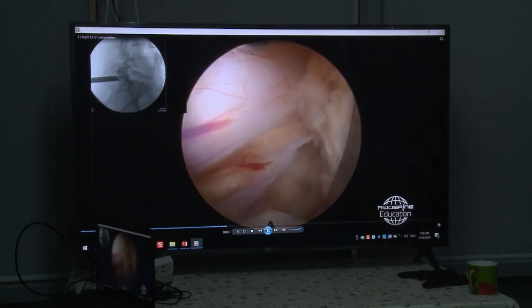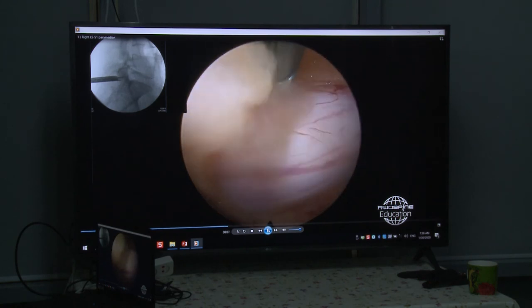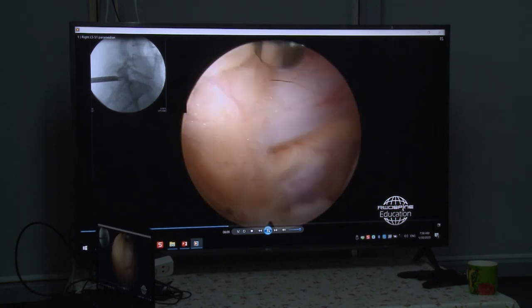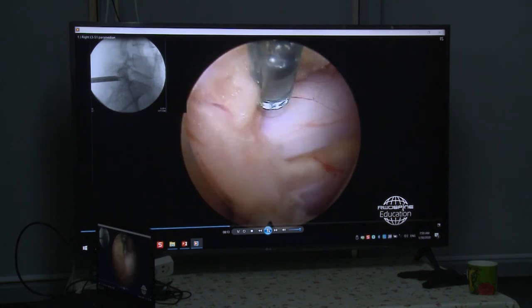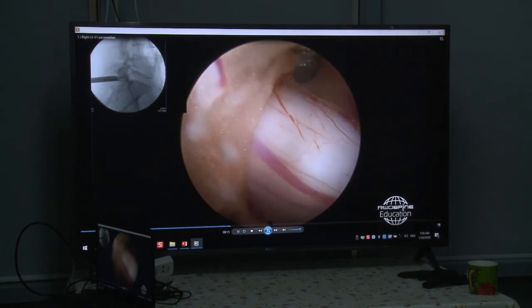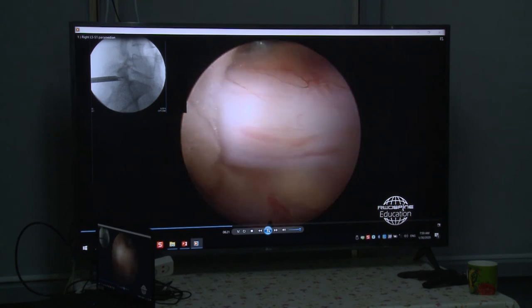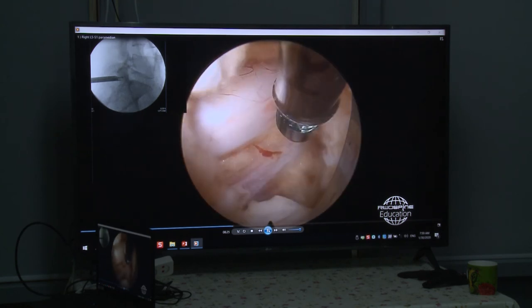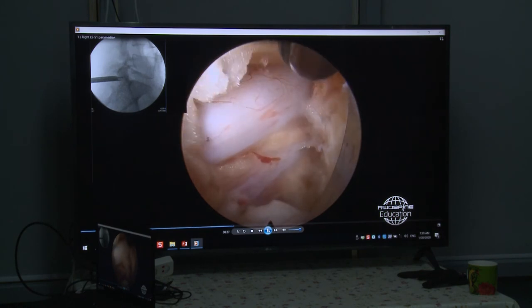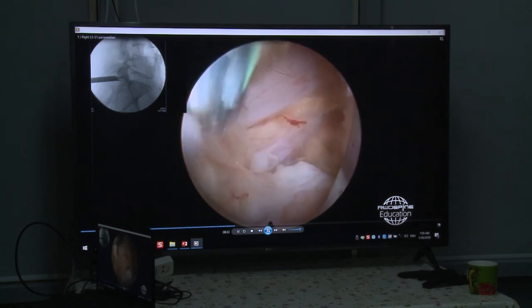So first look medial. And for example, here we see this structure ends here medial. That can only be the nerve. So I'm sure that I'm here lateral of all neural structures, and I can manipulate the neural structures medially without problems, and I can work without risk of damaging the traversing nerve.